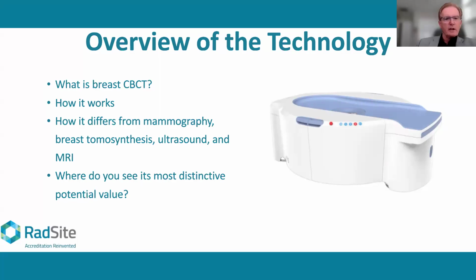So we clearly understand now not only how the technology works, but how we're using that technology to advance early stage breast cancer detection. And I appreciate the fact that we're comparing it in multiple ways to conventional mammography, to MRI, for an example, the ability that we have to use the breast CT with and without contrast when warranted. So this gives us an open opportunity to understand the broader feature sets of breast CT.